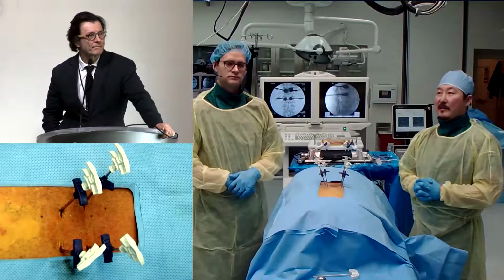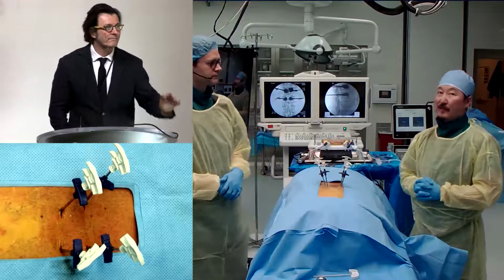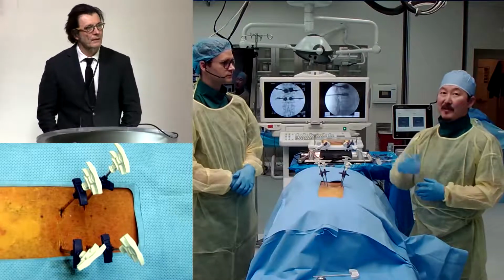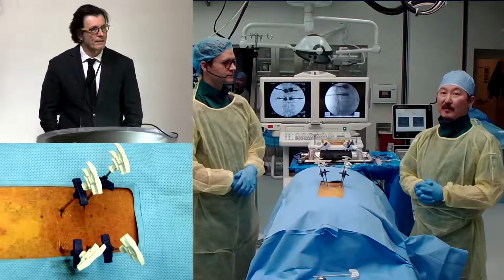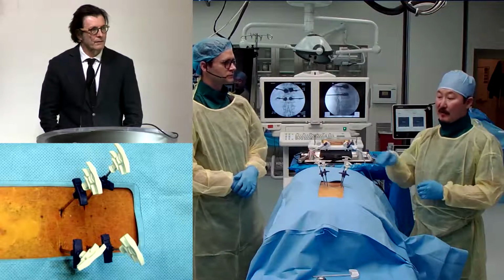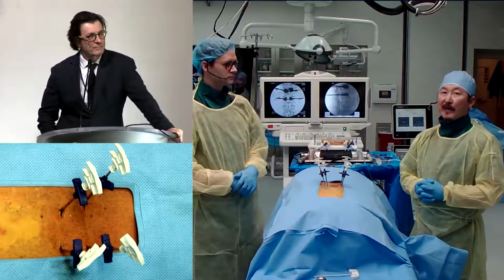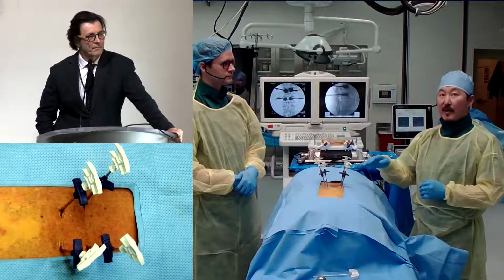Luckily it's never happened to me, but I've had patients referred to me, and I'm sure many of you have as well. The first thing I would do, if the patient ended up with new pain, weakness, or paresthesias postoperatively, is send that patient immediately for a CT scan to confirm the diagnosis. If there's evidence that there's cement extravasated in the canal, I would take the patient back in for decompression. What do you mean by decompression? I would typically do a laminotomy, and then I would explore that area.